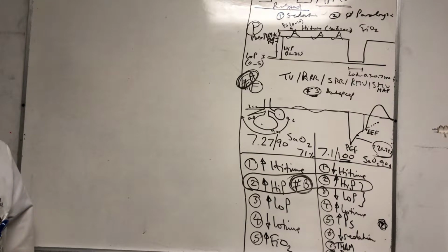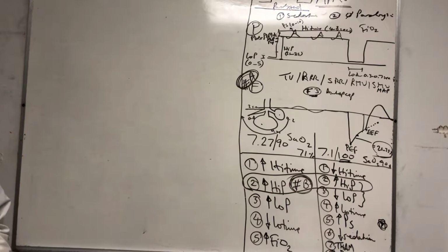When you see somebody that is still a little bit hypoxic, you know, 92, 93, or still having schmutz on the x-ray, still not completely recruited, these are the patients you wean using drop and drag, because you don't want to affect the oxygenation.